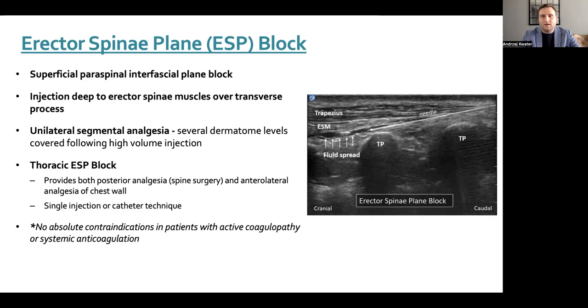at the meeting. The goal is to identify the transverse process and to not identify the ribs or the lamina. And there's a distinct ultrasound image of each of these structures that we're looking for as we're scanning in the sagittal orientation, left and right, away from midline, being able to identify these various structures and identify what's actually the transverse process, since you should not be visualizing pleura if you're identifying the transverse process.